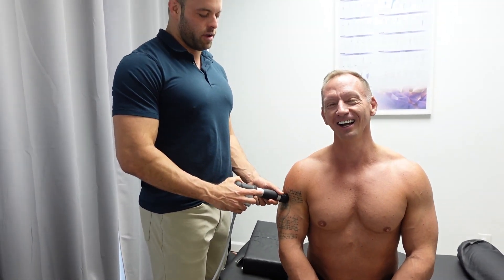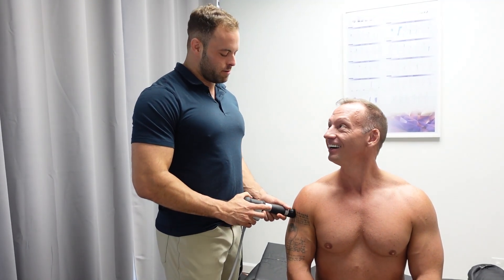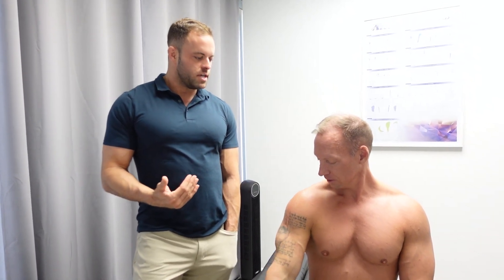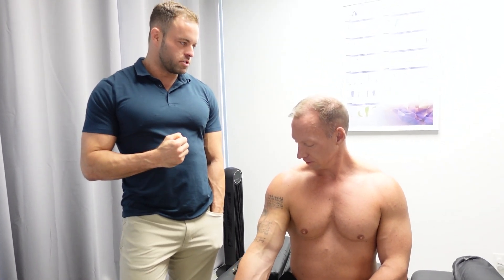There are actually anabolic effects of Shockwave — that would have to be studied! Okay guys, so that's about halfway through treatment. Typically we're going to do about 2,000 pulses. So Dr. Eric, how's your experience with the Shockwave so far?